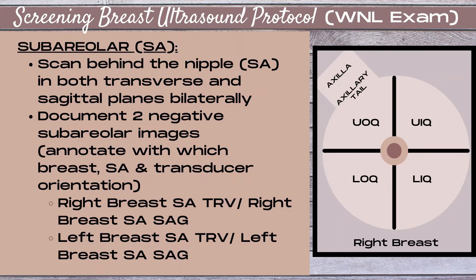Continuing with our screening breast ultrasound protocol for a normal exam — next I would move on to the subareolar region. This is annotated SA, and this is the tissue back behind the nipple. You want to scan it in both a transverse and a sagittal plane. When you've ensured there's nothing hiding back there, document two negative subareolar images annotated with which breast you're in, SA for subareolar, and your transducer orientation — for example, right breast SA transverse and right breast SA sagittal — then the same for the left breast.